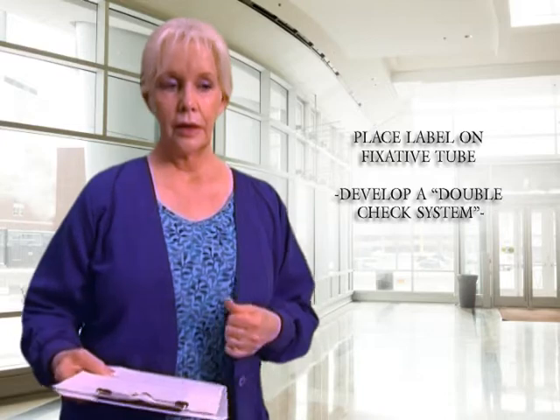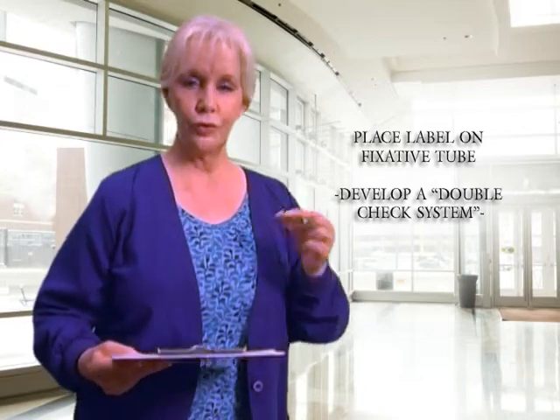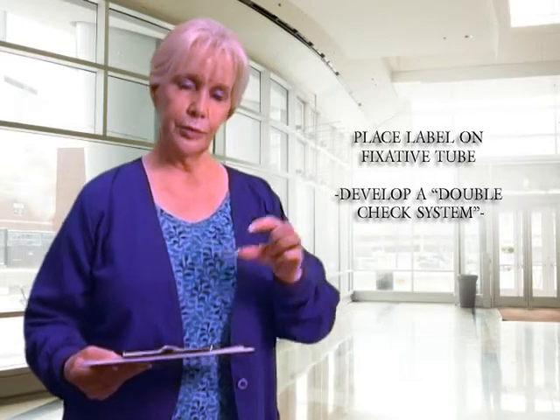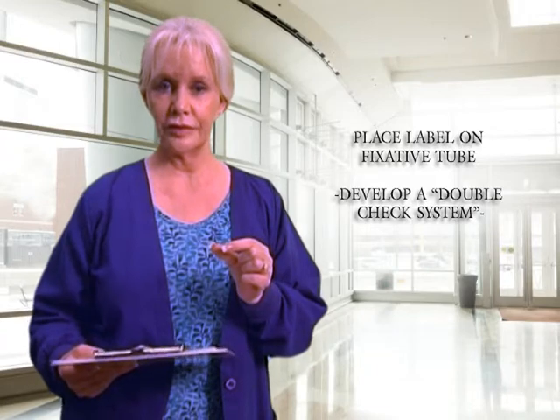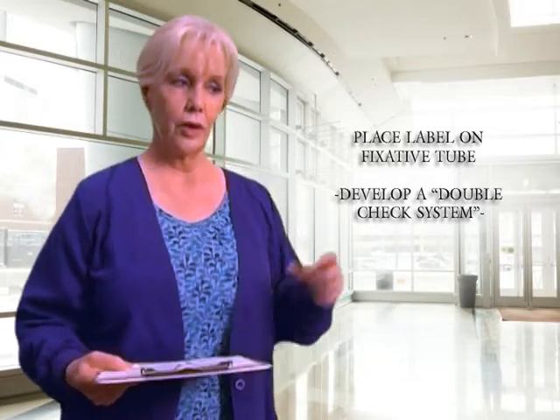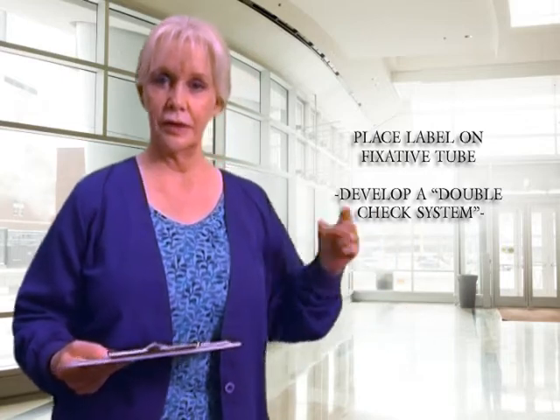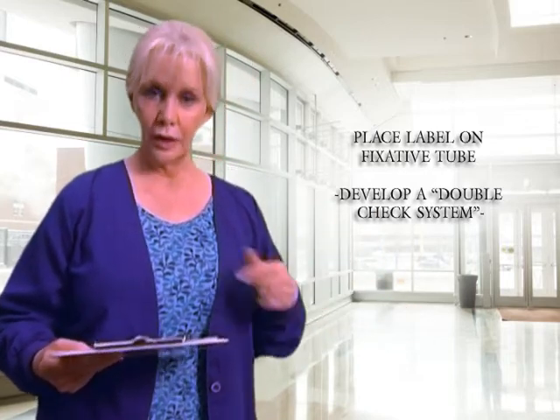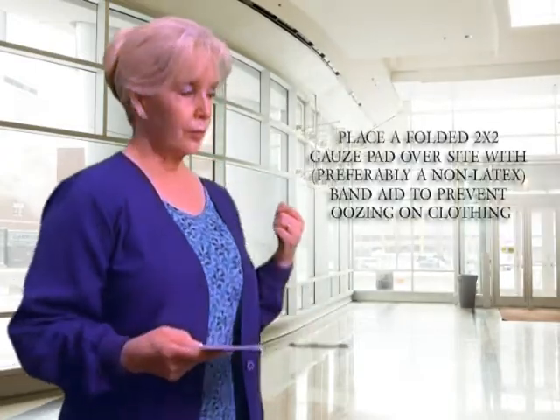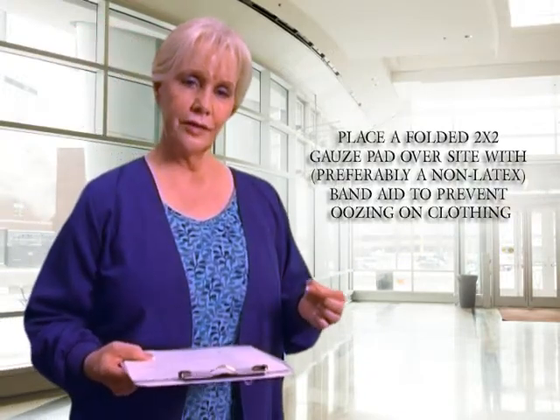I like to use what we call a double-check system. We make our labels out ahead of time, but we do not label the tube in advance. If you label the tube early and someone picks up the wrong site, you're not inclined to catch that error. So we label our specimens right after the specimen is entered into the tube, and then both of us call out the site together.